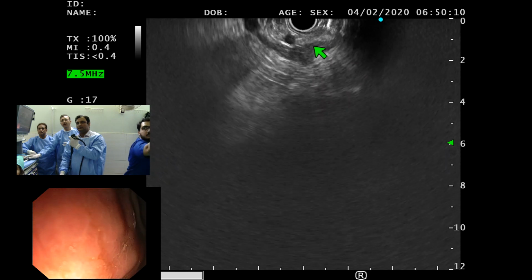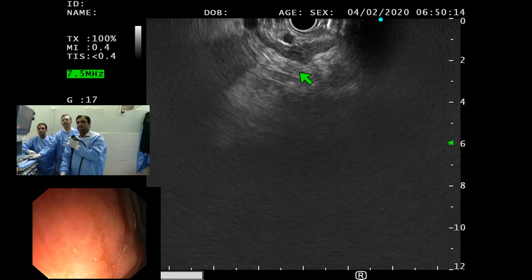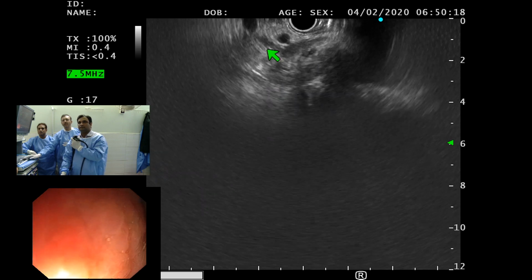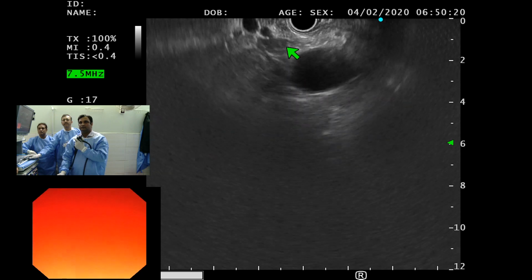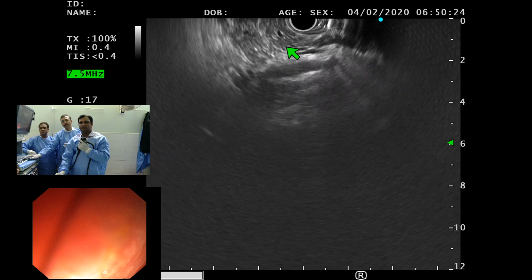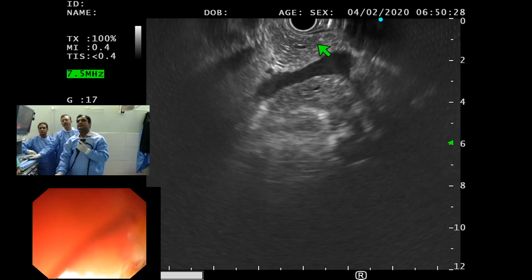This is the adrenal. See the little hyperechoic lining of the adrenal normally. Good demonstration of right adrenal. Okay, left adrenal. Excellent. Keep going. Bring the PD back under your transducer, and from there, this is confluence.